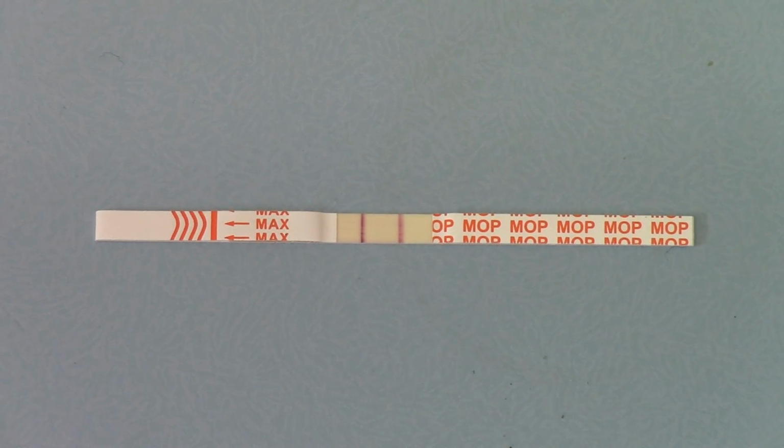The test line is the one nearest the dipped end, and this is a negative binding technology, so if there was any opiates at 300 nanogram concentration or above in this control solution, you would have no dye forming at the test line area and no line forming as a consequence. So you'd have in a positive opiate test just one control line showing with no test line at the read time, which for these tests is 5 to 10 minutes. And in this negative result you can see the clear two lines forming in the central section.